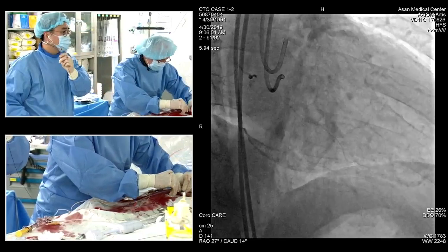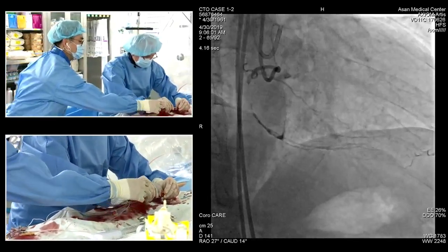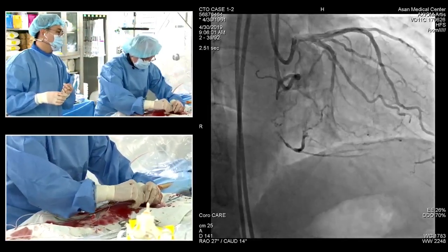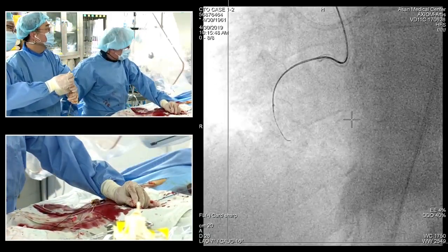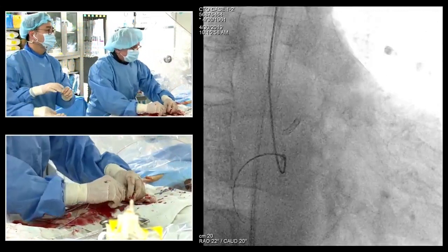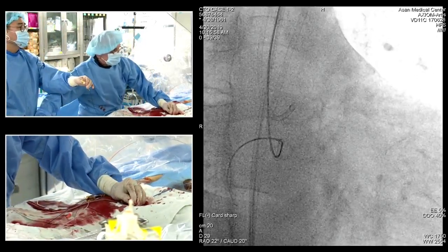I have the impression that there is also some maybe septal option, maybe. And I know that Gerald is also very good on the epicardial tracking, so therefore... Let's go to Ario, please. Ario. Oh, sorry. Look. But it's always the question, how long should we persist on one strategy, isn't it, before we change?